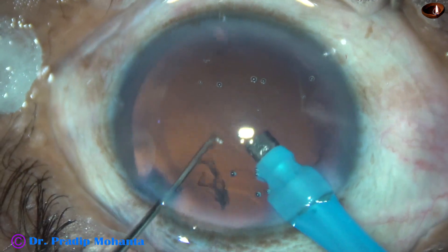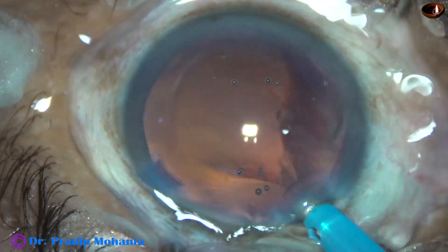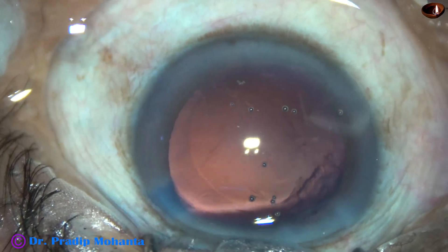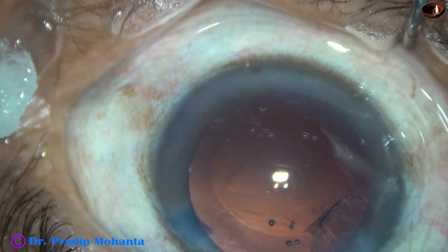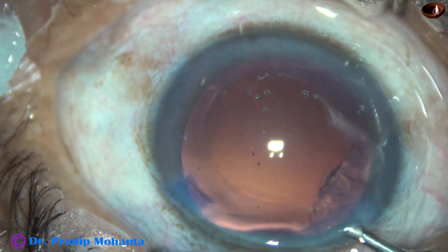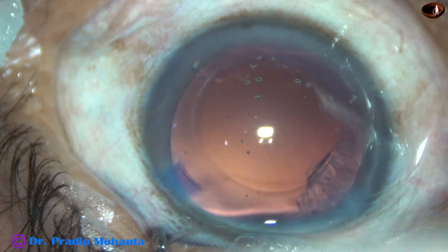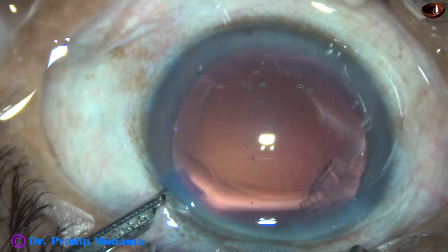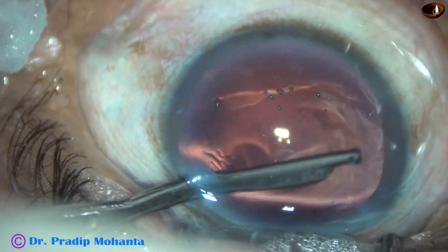In this case, there is hardly any cortex left. Injecting some visco — there is some cortex at around 10:30 o'clock. I go through the left side port and remove it with the Simcoe.